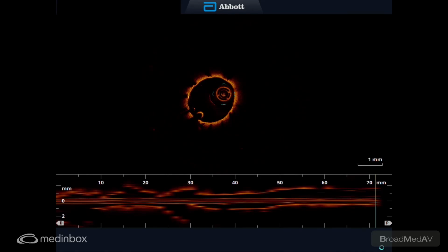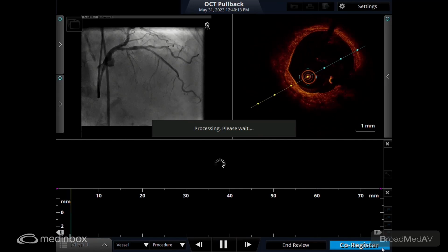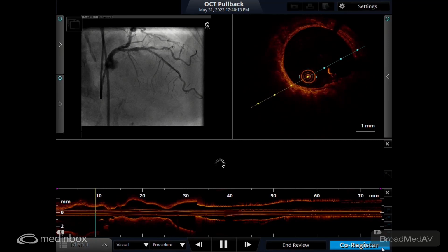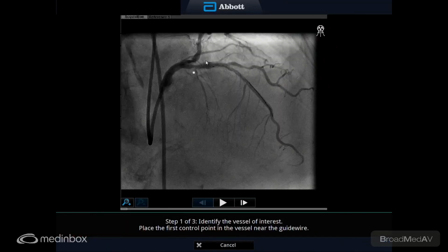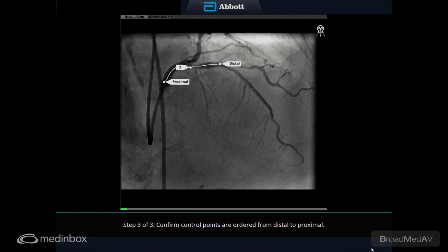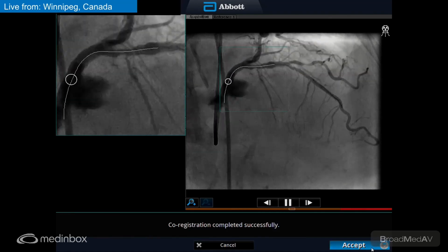I think I like the way, at least angiographically, where the nodules have gone. You think that's just wire in the midsection? Wire flow, or is there something going on there? We'll take a look. Hopefully, should we go deeper with OCT? I think you're there. I would. Let's see. Go reg this for now. Thanks, Christian. Perfect. Let's accept it there.